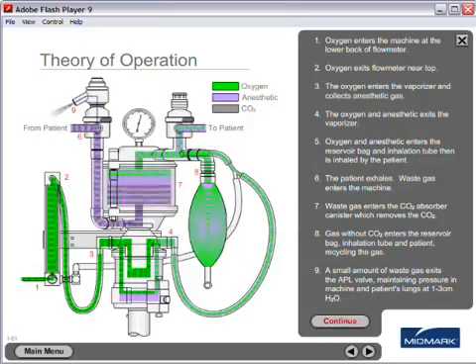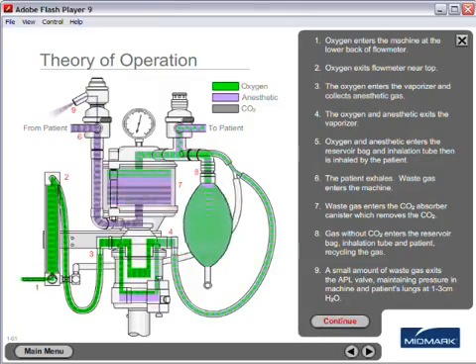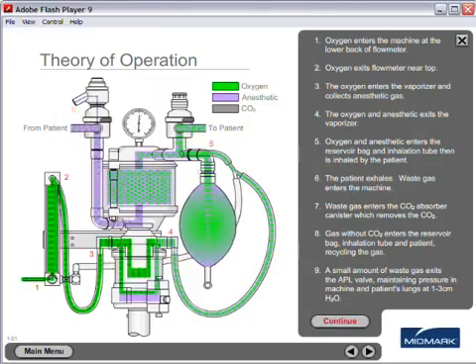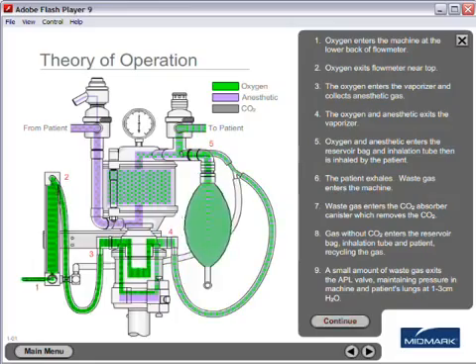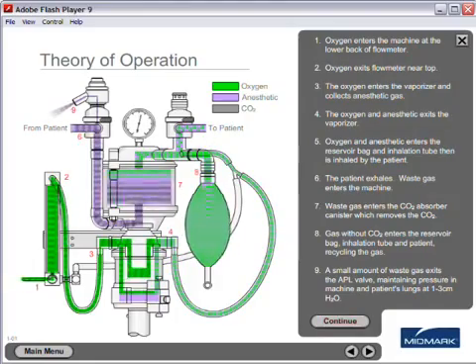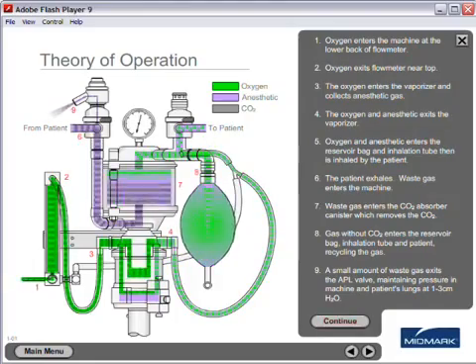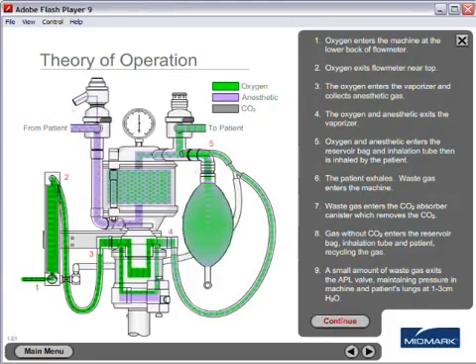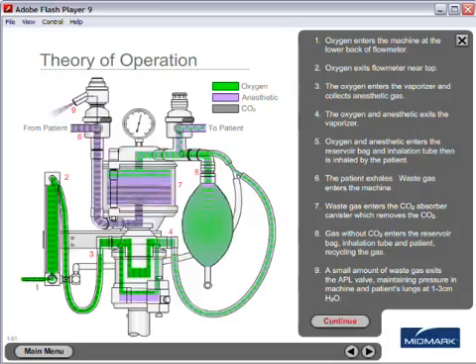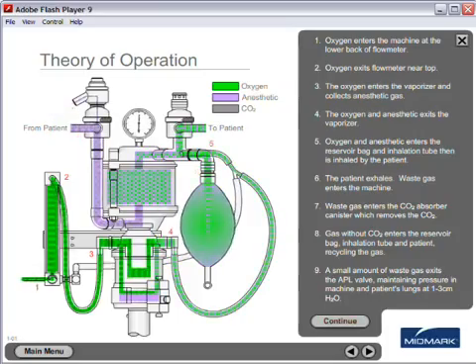Number nine, a small amount of waste gas exits the APL valve, maintaining pressure in the machine and patient's lungs at one to three centimeters H2O.